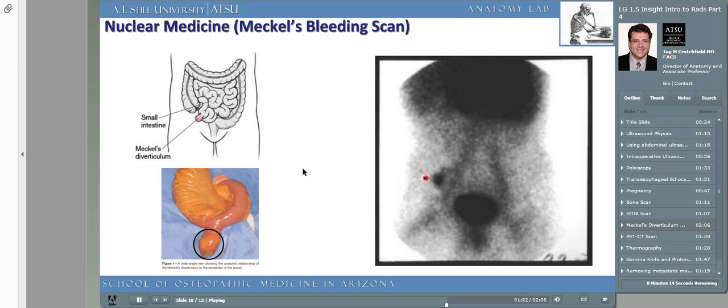But a Meckel's is a name for a very specific pouch, occurring in the small bowel, 2 feet proximal to the ileocecal valve, about 2 inches in size, that contains two types of mucosa, usually. A Meckel scan allows the physician to localize the Meckel's diverticulum and assess whether it is present and bleeding or not. Let's take a look at another test that relies on radioactive material.